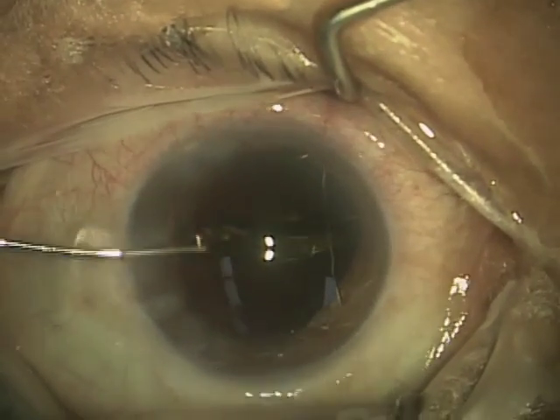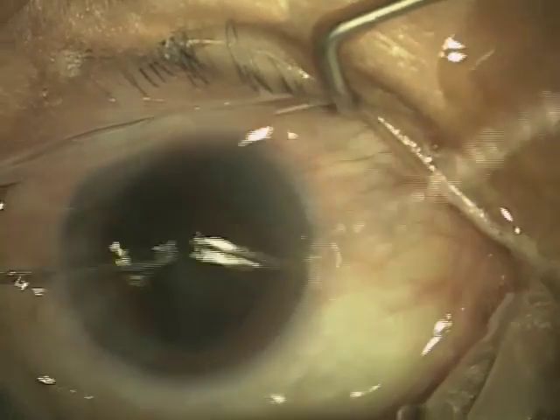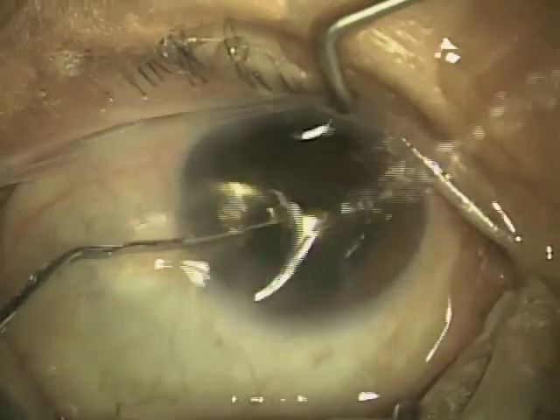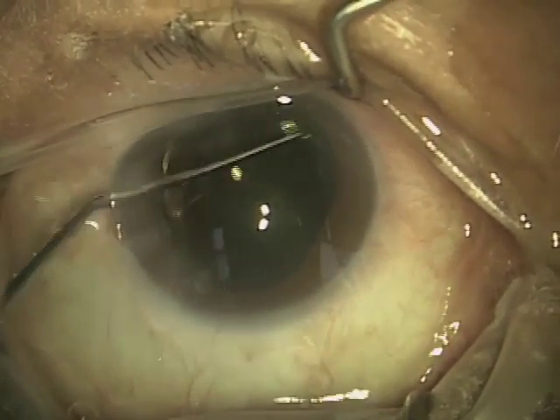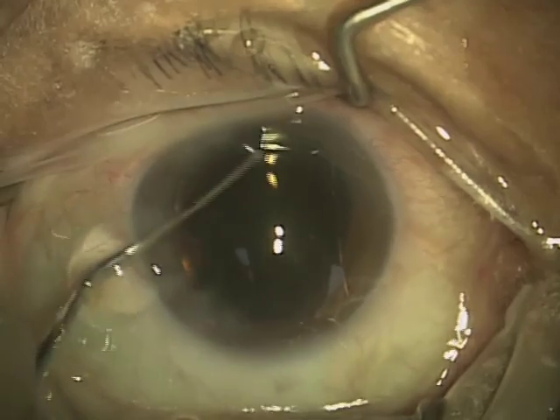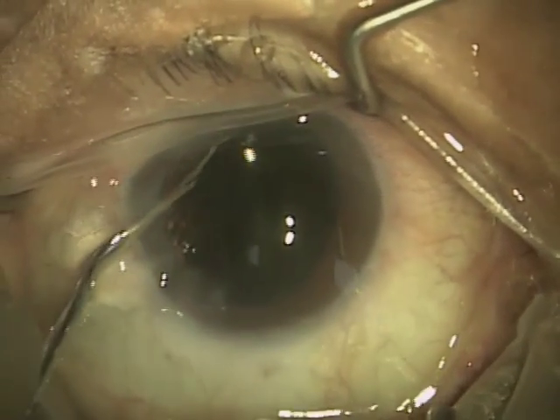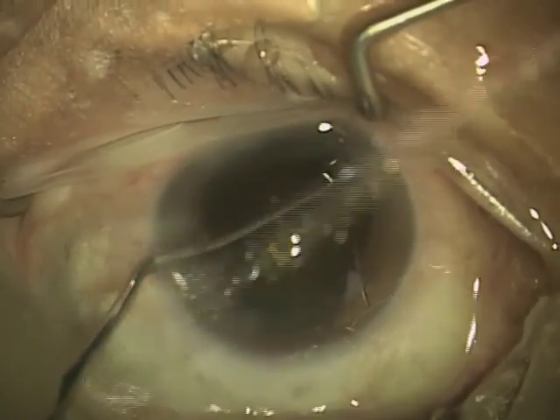This allows me to use a smaller incision size — again, 2.2 millimeters. Incision sizes range from 1.8 all the way up to 3.2, and we really don't see much larger than 3.2 now. Years ago, incisions were as large as 11 to 13 millimeters. That may not seem like a lot, but when you're talking about the eye, it's pretty big.